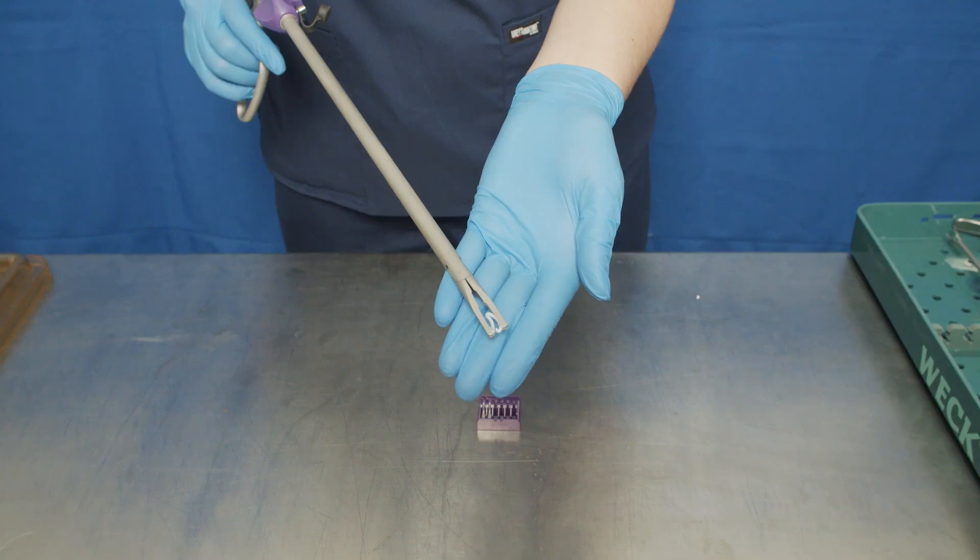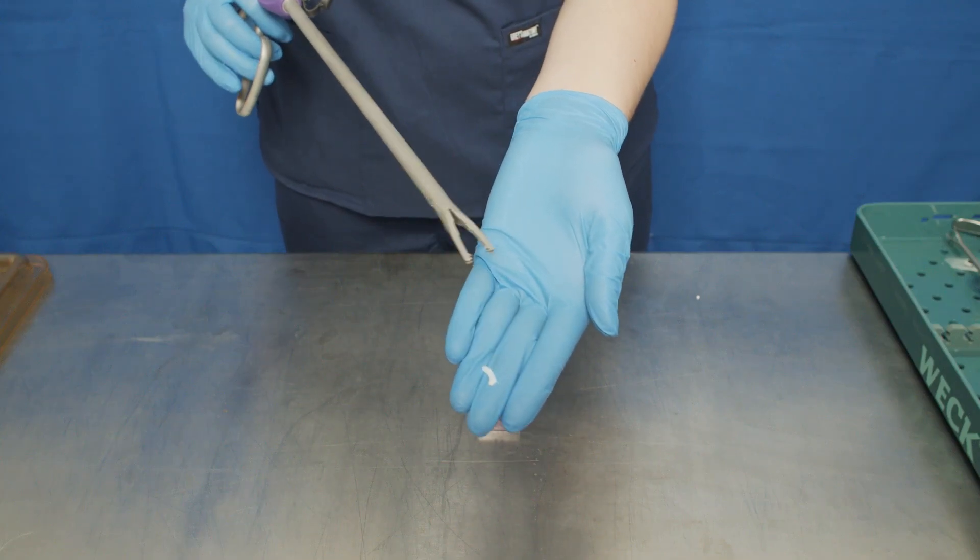Fire the clip by applying force to the applier handles until the jaws close and the clip locks.